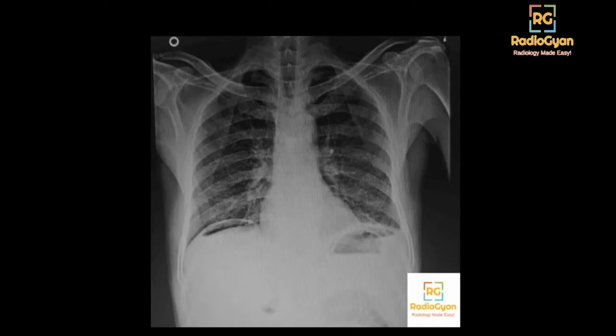What we see here is air under both domes of the diaphragm, which is quite reassuring for the diagnosis. This is a case of pneumoperitoneum — a straightforward case, but there are a few common issues and questions associated with this case that are often asked in the exam.